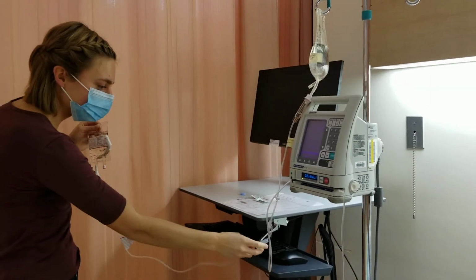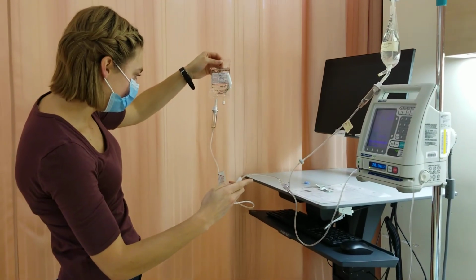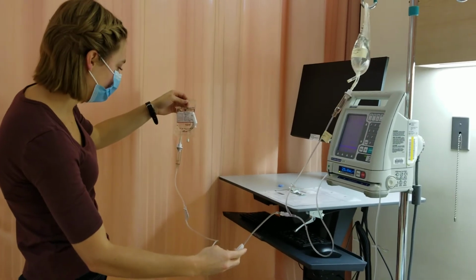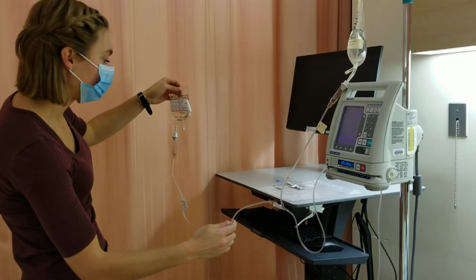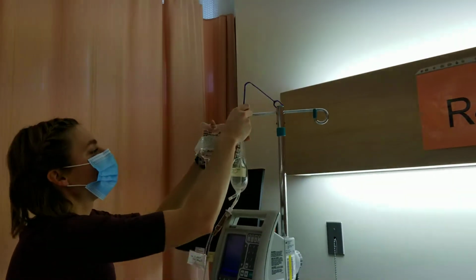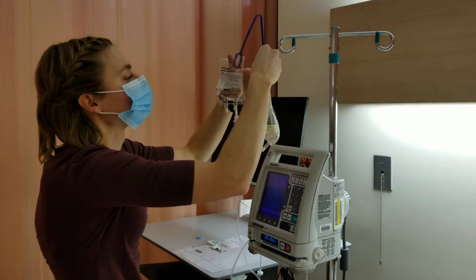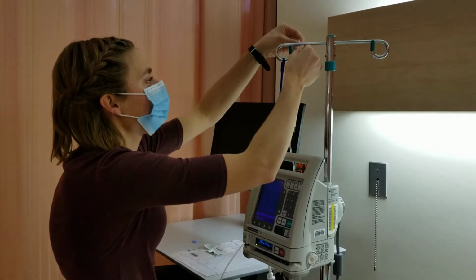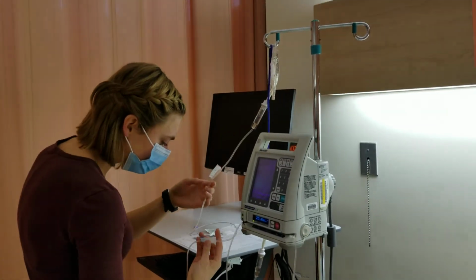So I can lower this and open up this clamp. See all the air come out. It's clamped right now with the settings on the second ring, so I have to close that up. It's about half full. It's good. And then lower this one. So that the entire medication will be given to you, I'm going to come back and do the saline flush after. So that you can put that up there, and I'll clamp this. So it's running at a rate of 15 minutes.